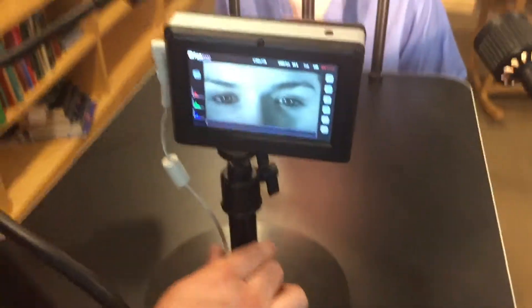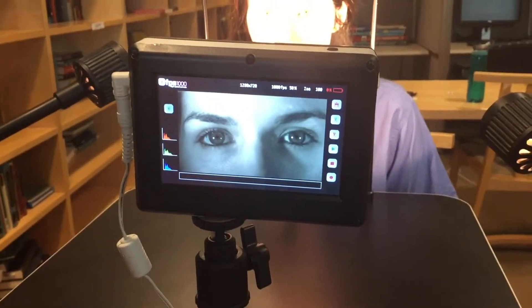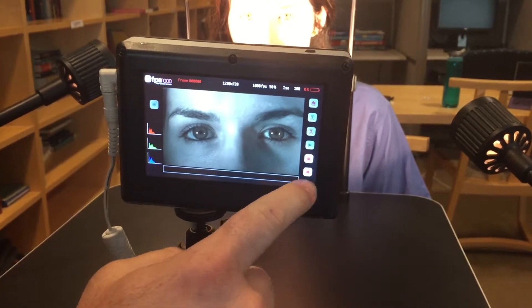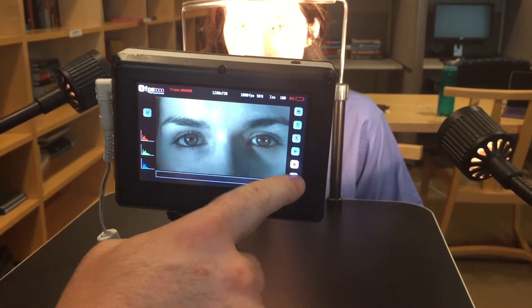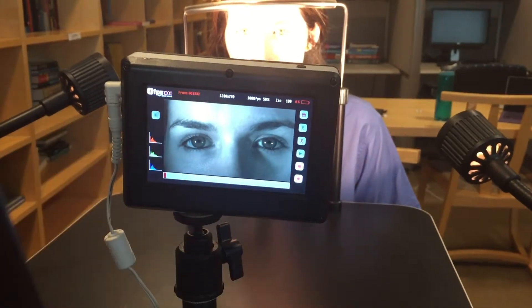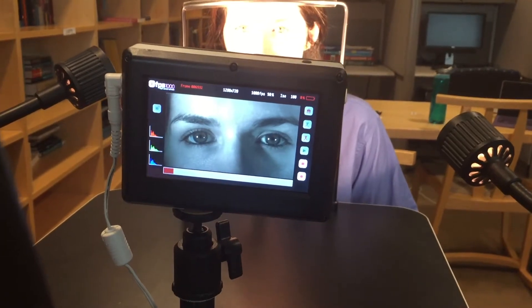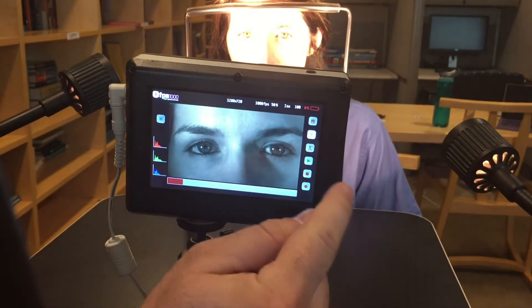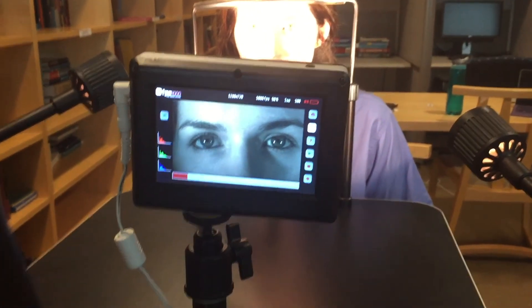Then you simply hit the record button once to get into record mode — it shows that you're in record mode here. Hit record twice and then you just wait for her to blink four times. She's already blinked once or twice; we'll pretend like she's blinked four and it's done. You can hit stop here and now you've recorded your patient. That's all you've got to do. Thanks!